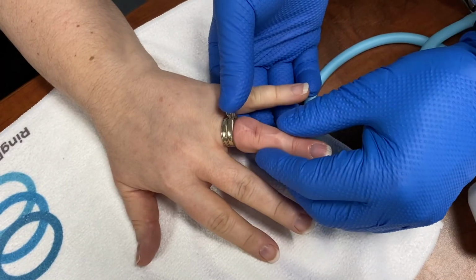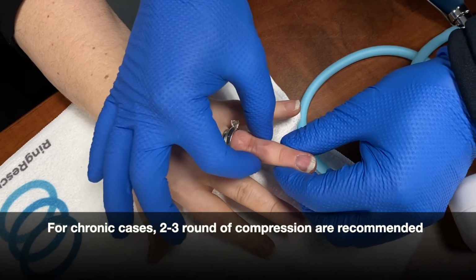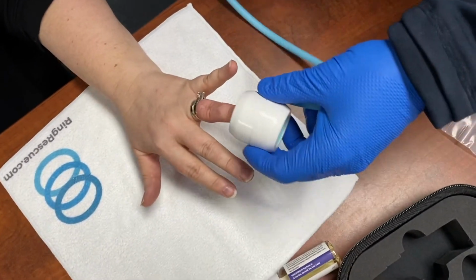I'm actually going to put the cuff on one more time, and I'm just going to try and get it right over this section, because this here, we're there. We need a little bit more compression right here, okay? So I'm going to put this on just one last time, okay?